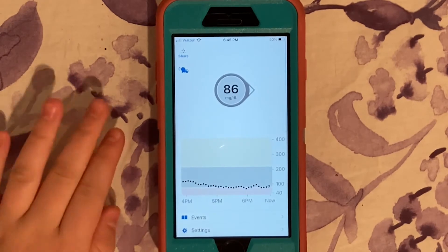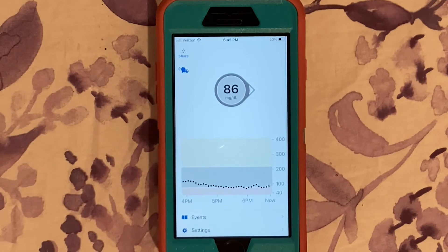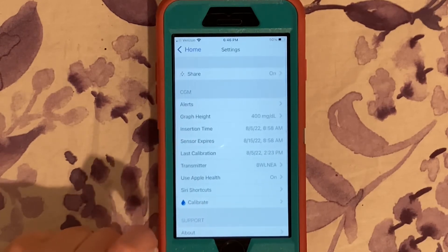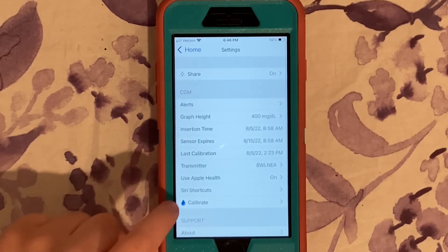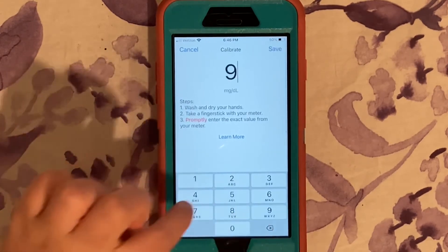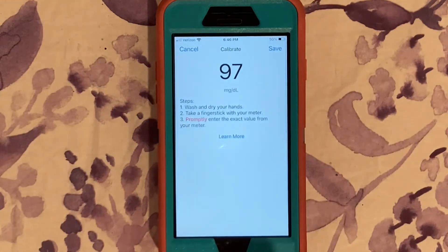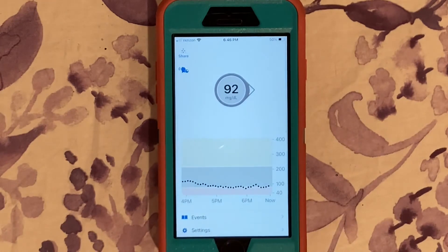As you can see, my Dexcom has gone up a little bit — that's fine, I can still calibrate it. As you may remember, I was at 97 according to my glucometer. To calibrate, go to settings and press Calibrate, then type in your glucometer number — 97 — press Save, then Confirm. Now it shows 92, which isn't exactly what my glucometer said but it's closer.